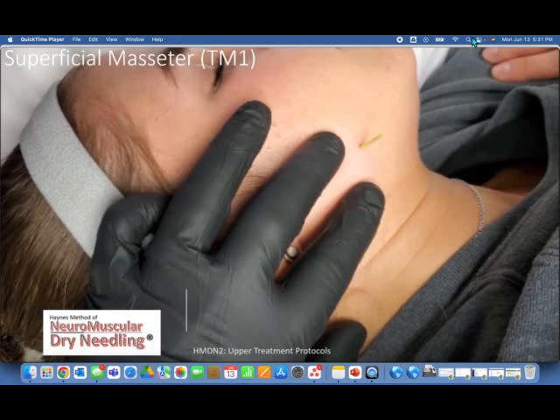So the needle that I'm using is a 2 centimeter needle. On some people we need just a little bit more, so a 3 centimeter may still be appropriate, but probably a 2. I believe this particular needle is a 0.16 diameter needle, so it's a little bit more tolerable than the 2.5 to 3 millimeter diameter. 0.2, 0.25, 0.3, not 3 millimeters.